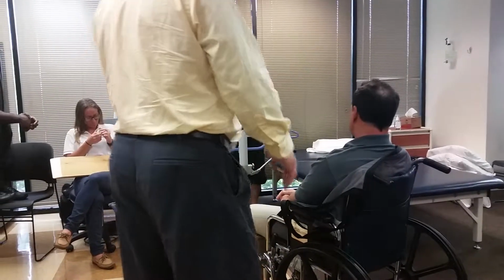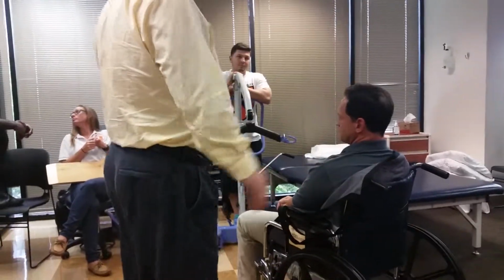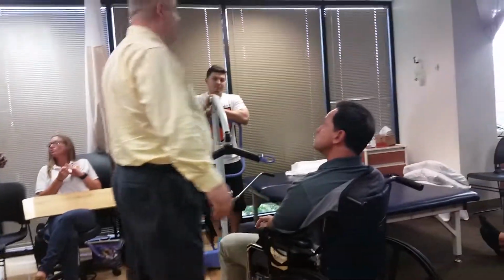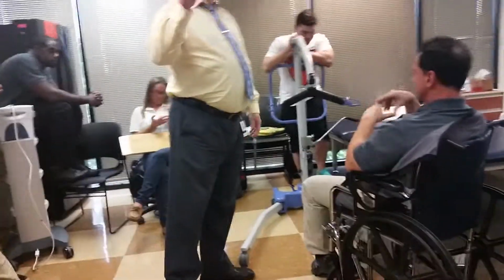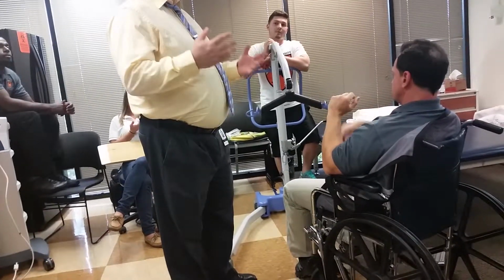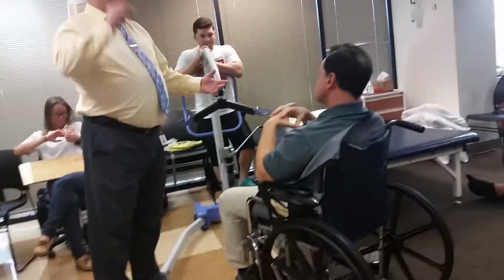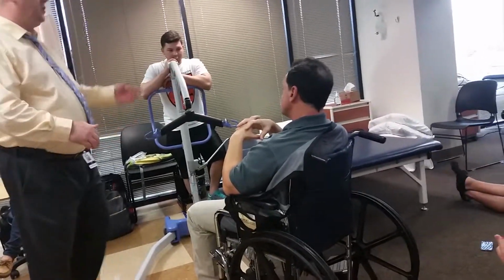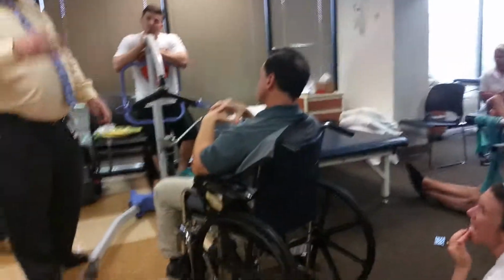Okay. Will this be noted as part of their program? Good question. So the question is, do we do balance training as part of physical therapy intervention? There's two schools of thought. One school is, how is this skilled therapy if we're using a machine to do something? If you're just using the machine to lift him up, to bring him to the chair, that's not part of a program, that's not skilled.